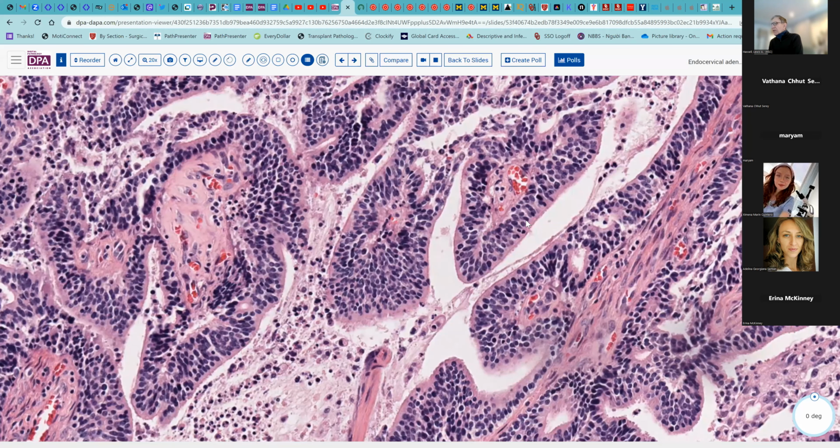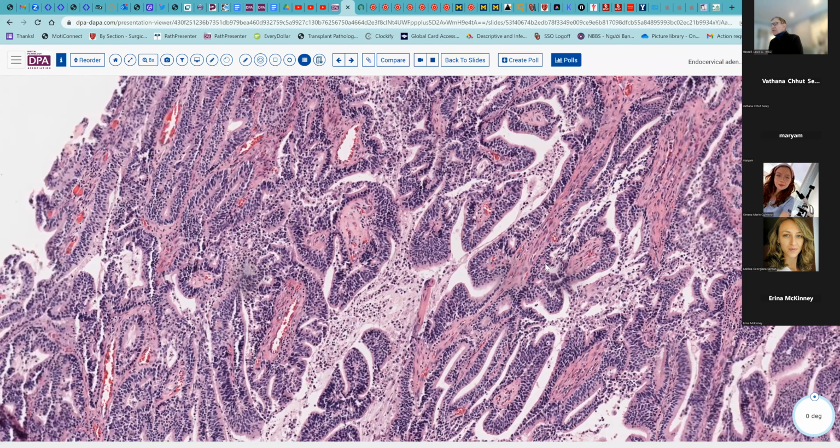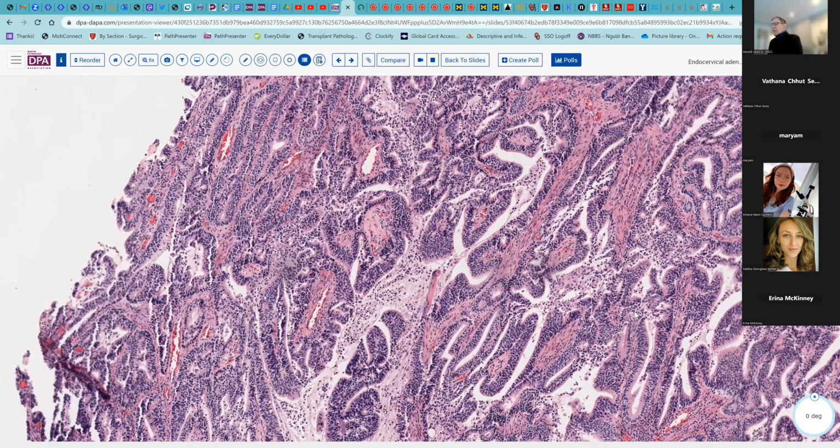And here's, I think, an example right here. There's a mitotic figure. Here's probably another one over here. And these are generally towards the surface rather than at the base of the glandular epithelium. And that's a helpful feature. Now, these lesions also are very strongly P16 positive. They're HPV related.